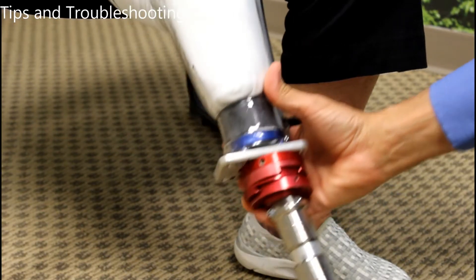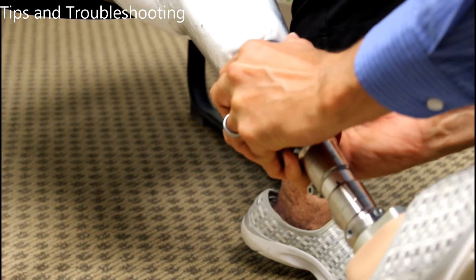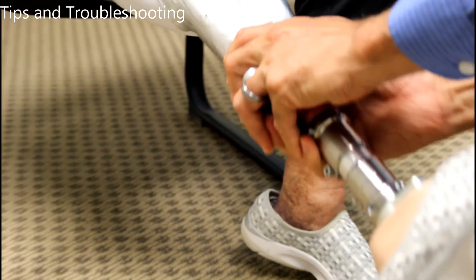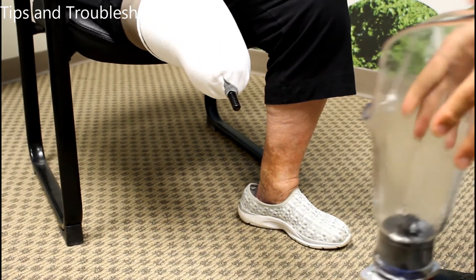If this does occur, you can have someone depress the button and pull the prosthetic firmly away from the body while you grasp the sock with two hands and pull toward the body. This may allow you to remove a prosthetic that has become stuck. If this does not work, it is best to wait until your prosthetic office opens and go in for an emergency visit.